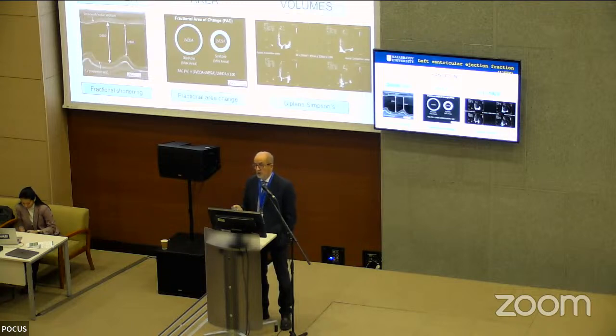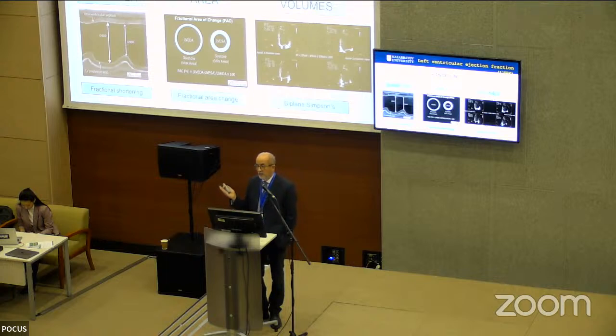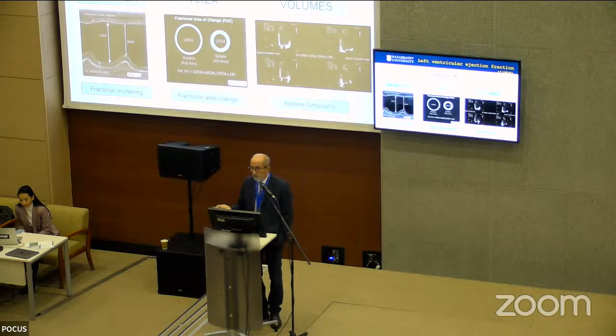And we, of course, can also assess changes in volume, making the measurements of the volume both in diastole and in systole from the apical four-chamber and two-chamber view. So the concept is the same. Of course, volumes are more precise than M mode, but the concept is the same: changes either in dimension, area, or volume.